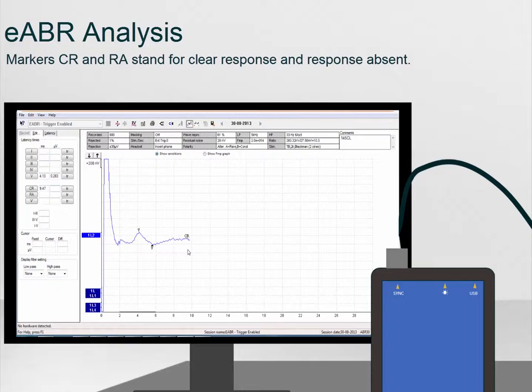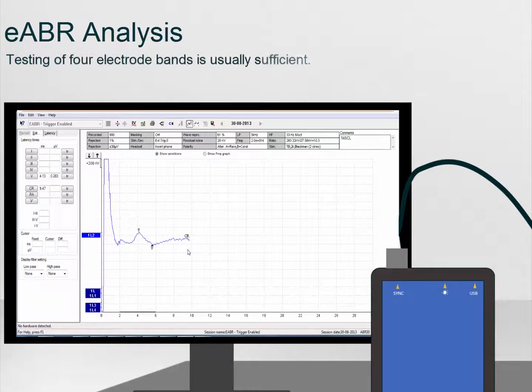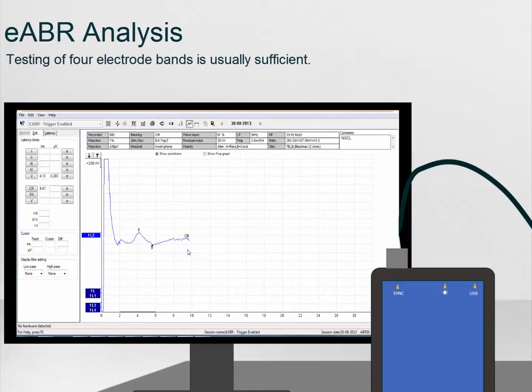When the waveforms have been correctly marked, select the next Cochlear Implant band to test. Often recording from 4 electrode bands in total is enough to provide the electrical threshold across all Cochlear Implant electrode bands.